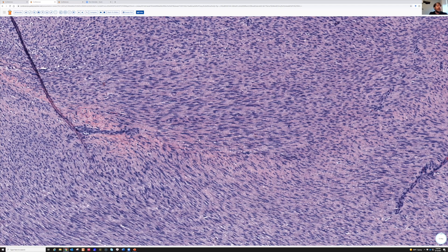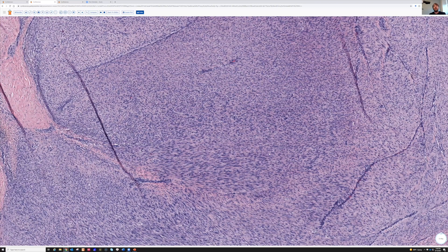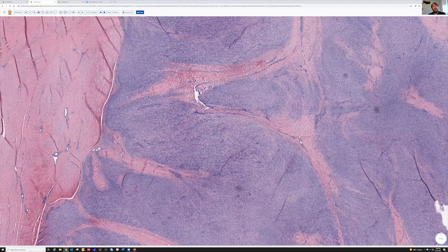Someone asked, should this be confirmed by IHC? You certainly can. Desmoid fibromatosis is classically known to have nuclear expression of beta-catenin. The problem with beta-catenin is it's a difficult stain to work with because it stains the cytoplasm of like everything, and cytoplasmic staining is totally nonspecific. What we need is to see nuclear staining, but in a thin spindle cell without much cytoplasm, when the cytoplasm picks up the stain, it makes it very difficult to see if the nuclei are truly staining or not.